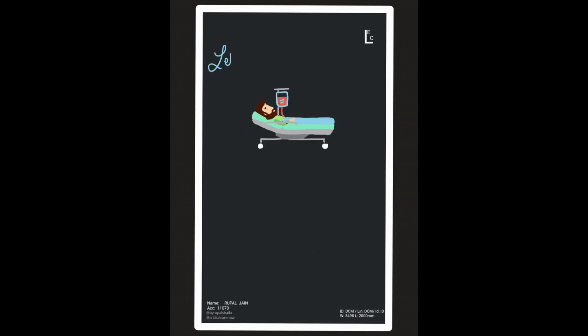All right, so let's start off with a case. We have a 47-year-old male, previously healthy, independently living, who is presenting to the emergency department with a witnessed onset of right hemiplegia, aphasia, and left gaze preference. His NIH stroke scale is 19. What do you want to do?